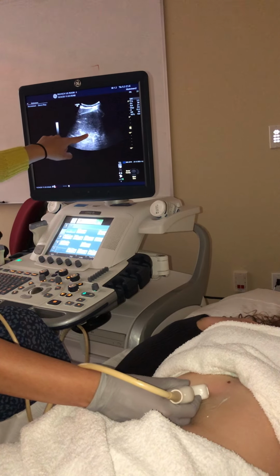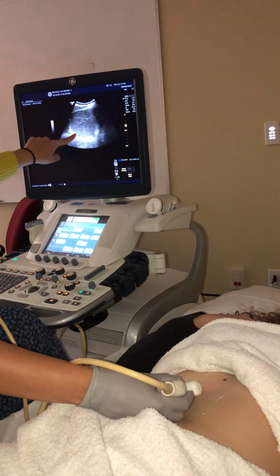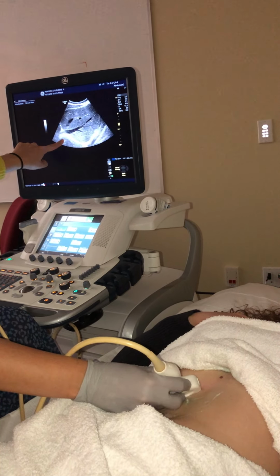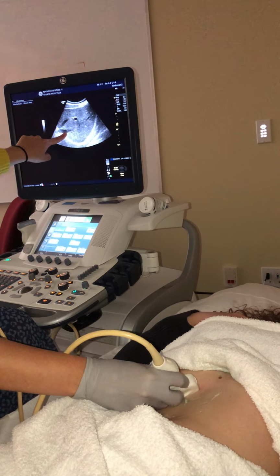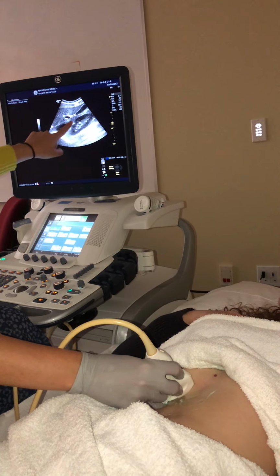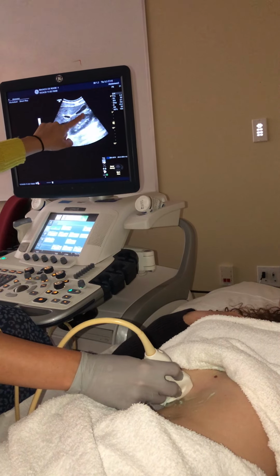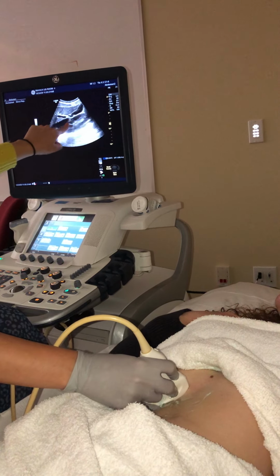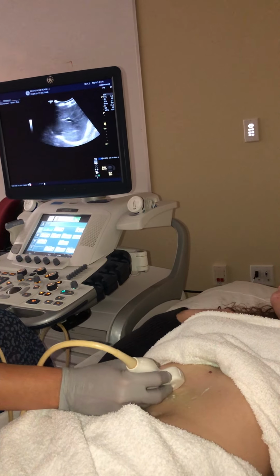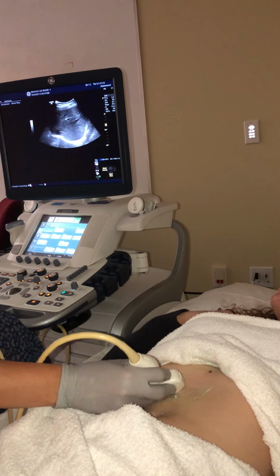We know we're getting the most superior portion of right lobe tissue, and we're coming down back towards her belly button. We have our hepatics coming in here. We have our portal vein there. We have our IVC coming in, gallbladder. We know that that's a landmark between the right and the left, and we have our right kidney here as well. So breathe, and whenever you're ready, take another big breath in and hold.